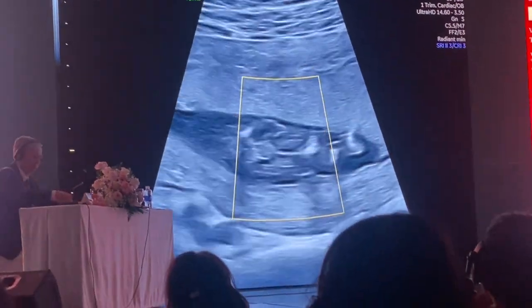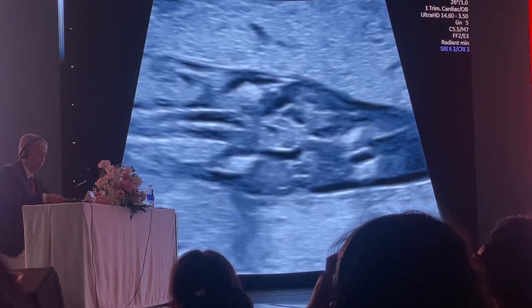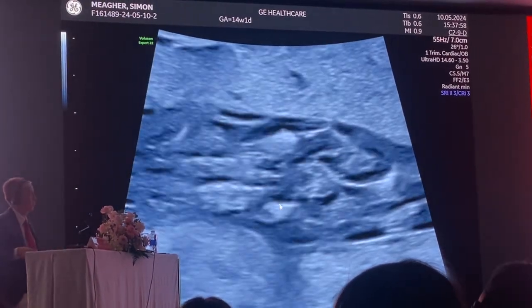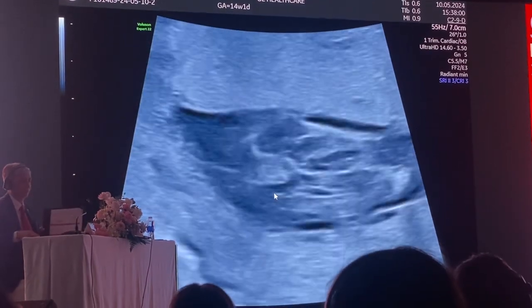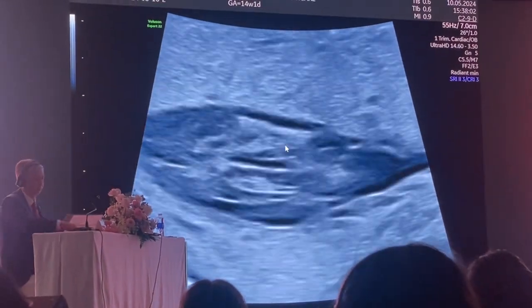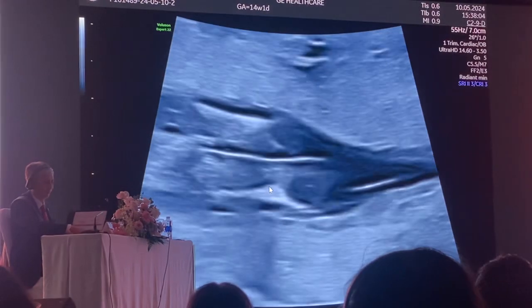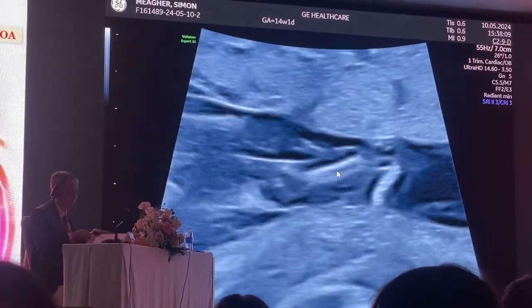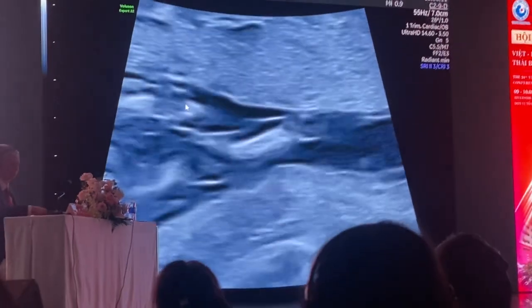And then I just go down to the iliac crest. So if I look at the iliac crest, I'm finished. Iliac crest, an iliac crest here, and an iliac crest here. Okay. And then I come down to the femur. I'm looking at the femur, and then I come down to the tibia and the fibula, on both sides.